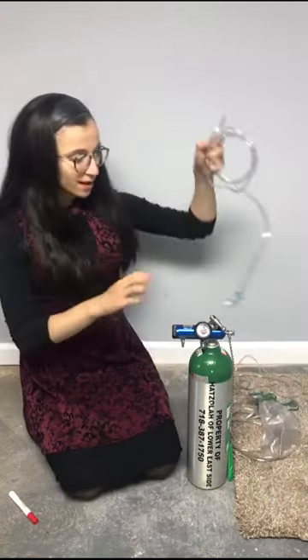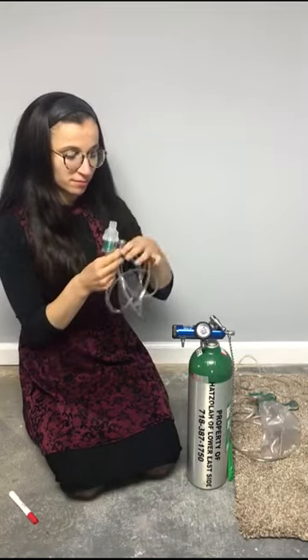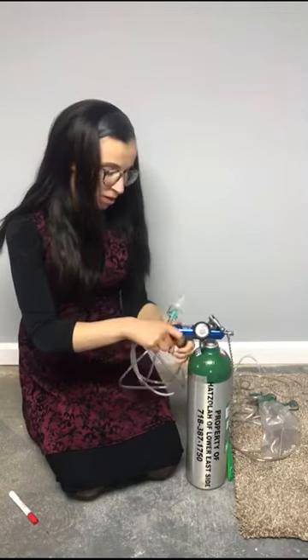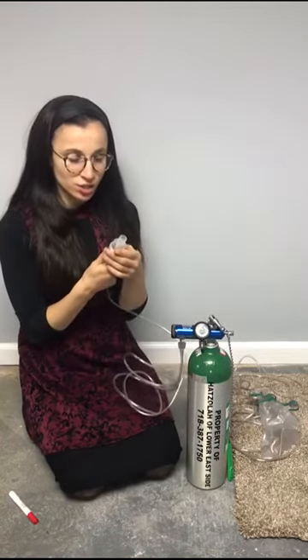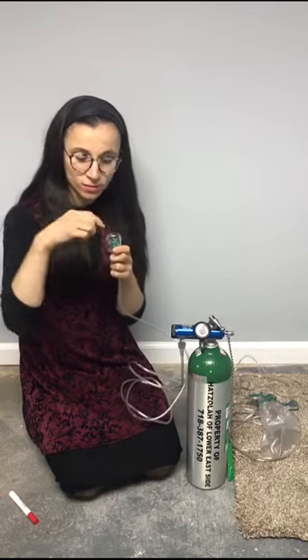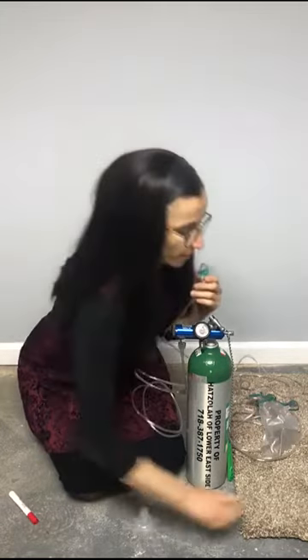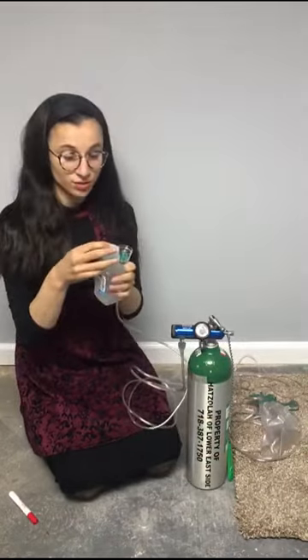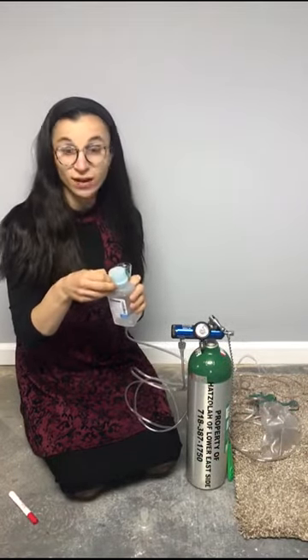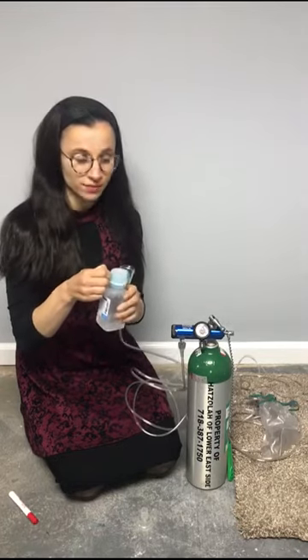Then, the last thing I want to show you is this. It connects to the tree, over here. Like we said before, oxygen is dry. So this is a way you put in water through here. It's also used to give medication through it. So you could give albuterol, which is almost always given through this.